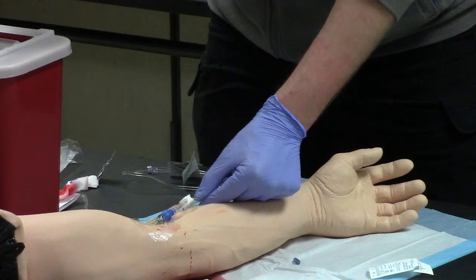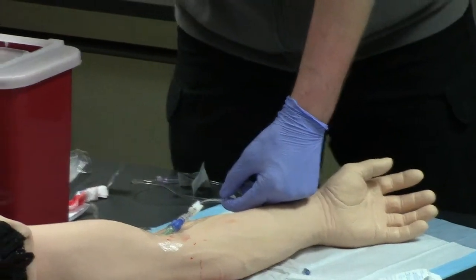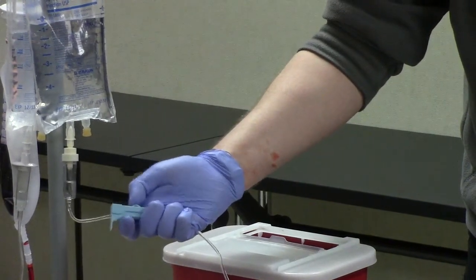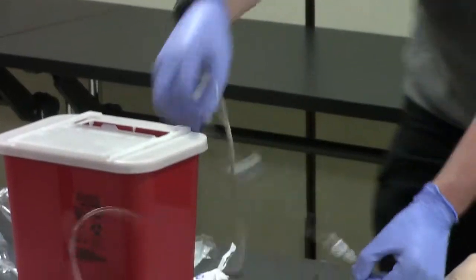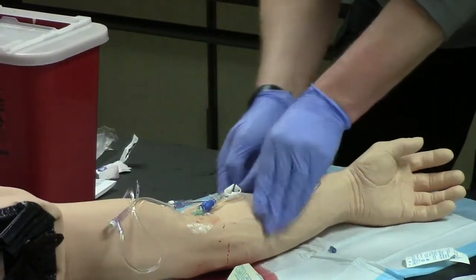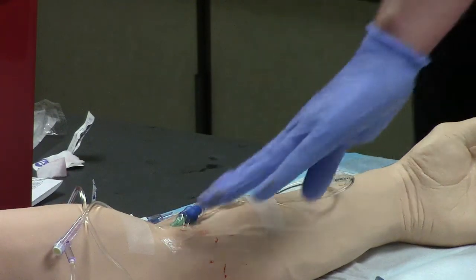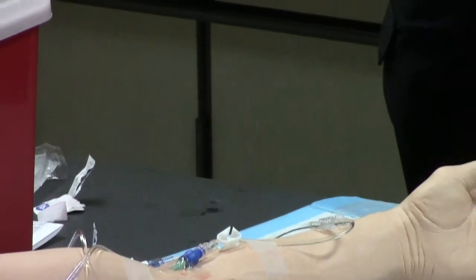Make sure we maintain sterility. Open up the roller clamp, flush the line to make sure we have good flow and everything's working properly, then adjust to the appropriate rate. If my patient needs fluid, typically we're going to leave it wide open. If they don't need fluid anymore, we can turn it down to TKO — to keep open — which is about one drop every three to five seconds, just enough to keep the line clear. We're going to make our loop below the injection site, secure the line in place so it doesn't get torn out, and then put one piece of tape above, just to help keep it in place. Verify that fluid is still running, make sure we're monitoring that site for infiltration, and then we are good to go to continue with our IV therapy.